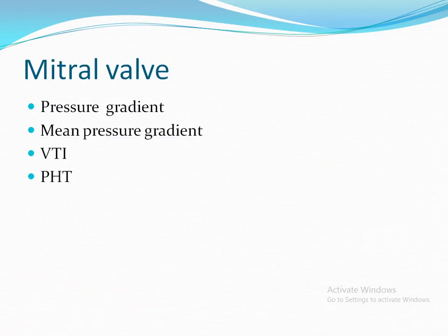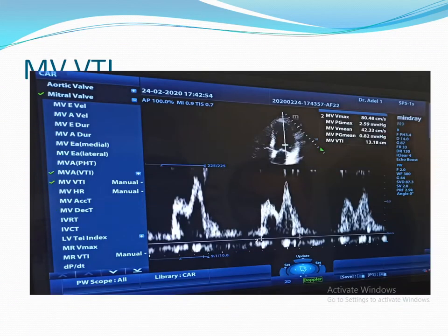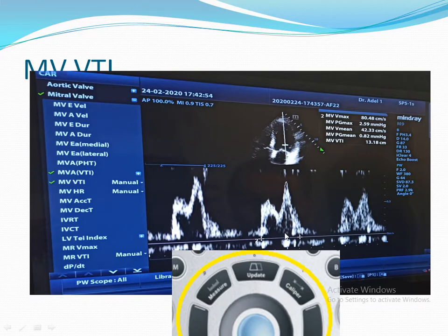For example, we will start with the Mitral Valve. After you get your wave, if you want to measure the pressure gradient, you have to press Caliper. Once you put your cursor on the peak of the wave, you will get the pressure gradient.